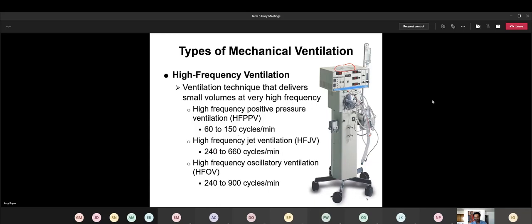If you do enough calibration, you'll just have it committed to memory. But I don't remember too many people who would memorize this. They'd always go back to the top of the machine and follow the steps for calibrating. And so, yeah, these machines look kind of like, wow, what's going on? It looks like there's a lot, but they really aren't. It's just a matter of getting familiarized with what's what. And then once you get familiarized with it, setup will be pretty easy.